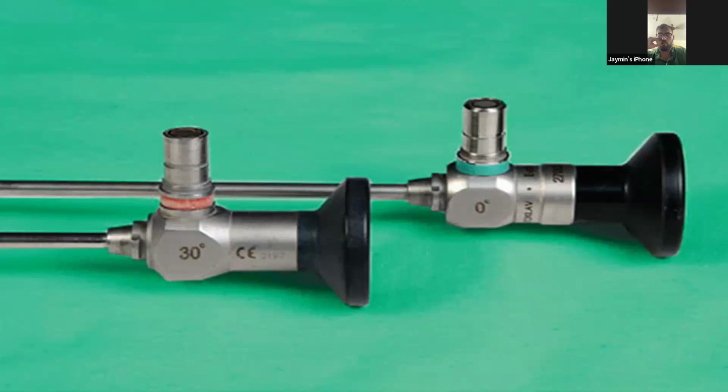Size of the telescope generally remains standard. It can be attached to any size of the sheath with a standard bridge. So the size doesn't change. And the light connectors will depend upon the make of the scope and the light cable. So there are adapters which can be used for connecting the light cable.